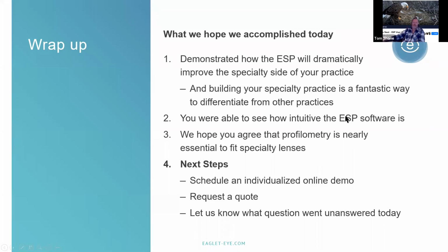I hope you've been able to see how intuitive the ESP software is. We're working very hard to make it very straightforward, not as complicated as some of the others out there, I believe. And we hope you agree. Fundamentally, the profilometry is nearly essential to fit specialty lenses. If not at this point in time, then certainly going forward, it's going to be more and more important. So the next steps, we'd be happy to do an individualized online demo.